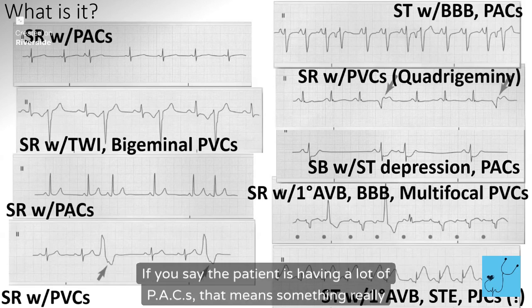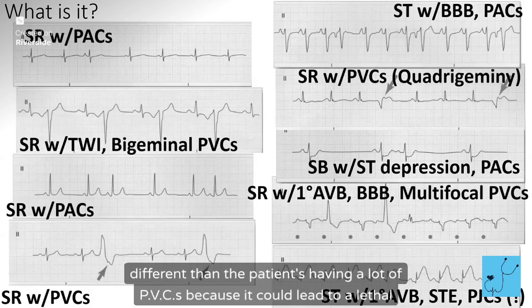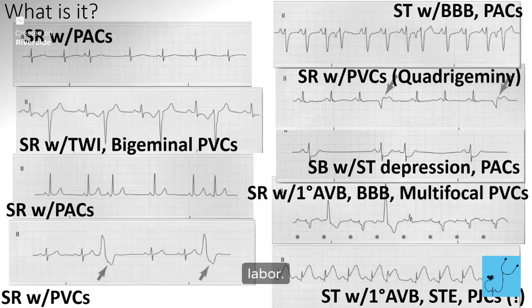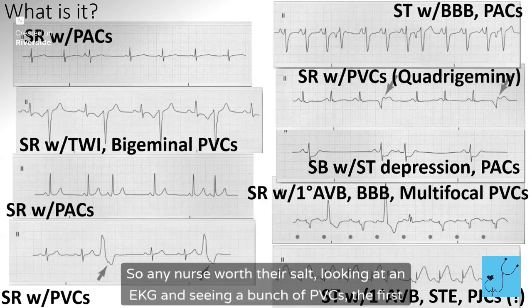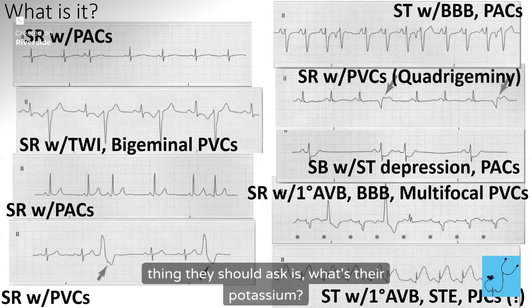If you say the patient is having a lot of PACs, that means something really different than the patient's having a lot of PVCs, because it could lead to a lethal rhythm. And it also could be easily fixed if it's an electrolyte problem. So any nurse worth their salt, looking at an EKG and seeing a bunch of PVCs, the first thing they should ask is, what's their potassium? What's their electrolytes? Because it's easy to fix and it's very common.